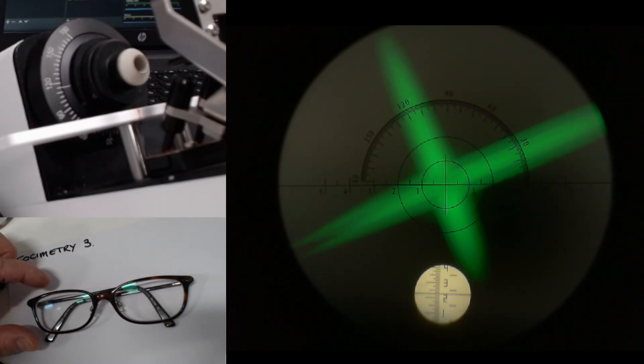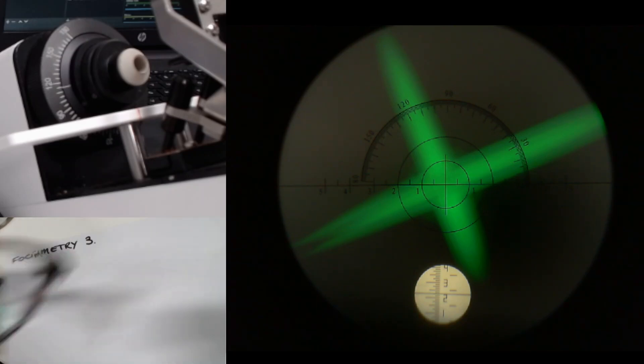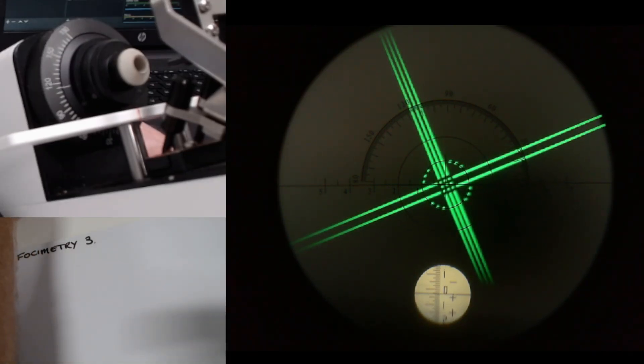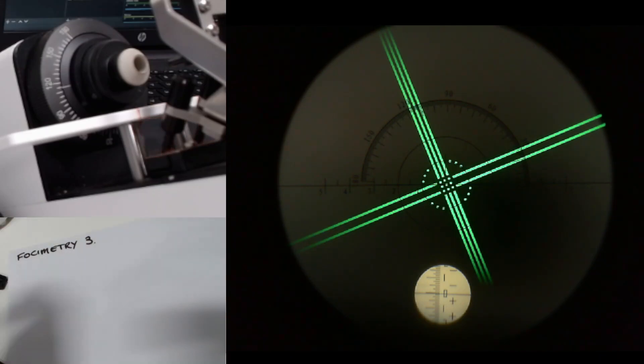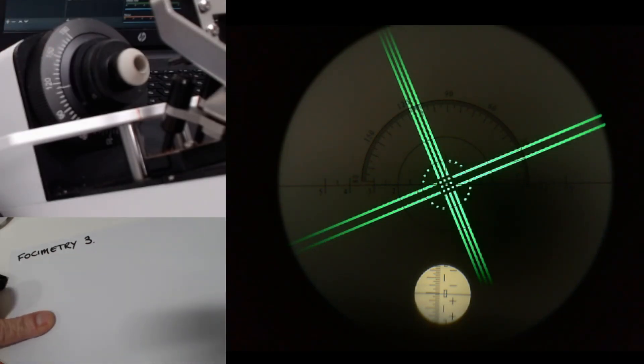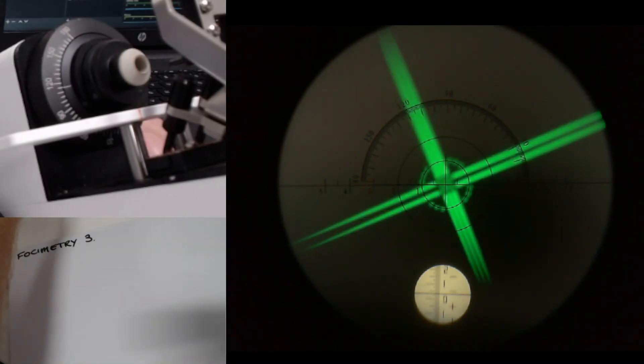This is the third set of specs we're going to use on the focimeter. Let me just get it all zeroed in — that looks nice and clear. You can see on the right side of the screen the view inside the focimeter. On the top left you can see the axis scale, and on the bottom left you can see where I'm going to write the details on the sheet. So let's start by moving the scale way up into the plus.